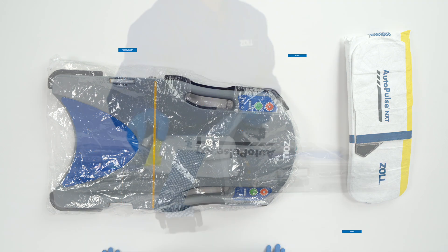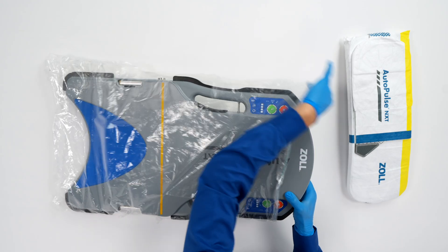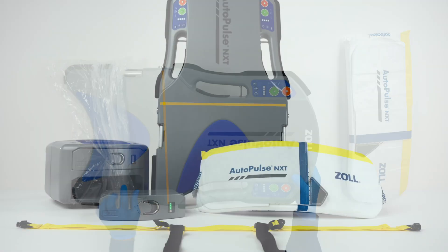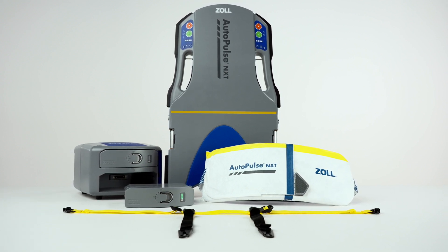To remove the hygiene barrier, you must first remove the AutoPulse NXT band. Next, pull the hygiene barrier down from the top of the platform and dispose of it. We have now reviewed how to use the hygiene barrier for the AutoPulse NXT Resuscitation System.